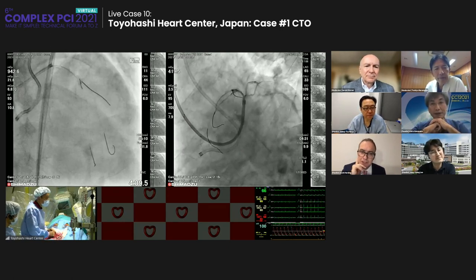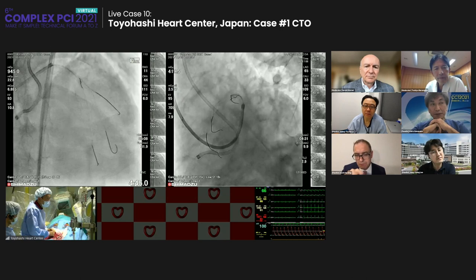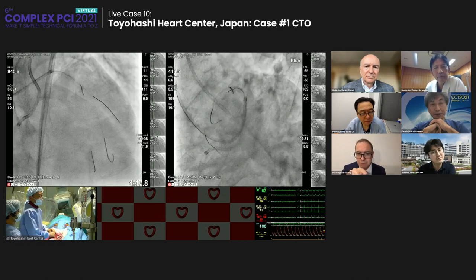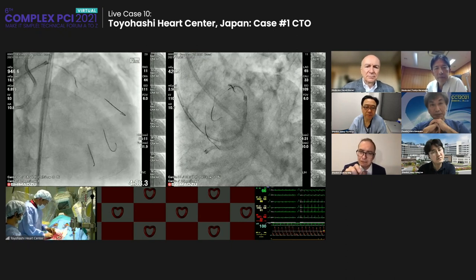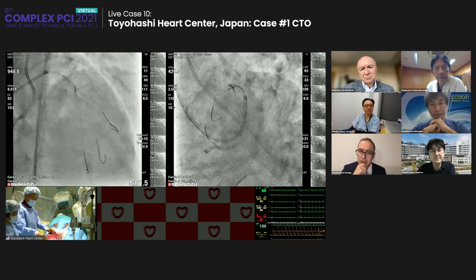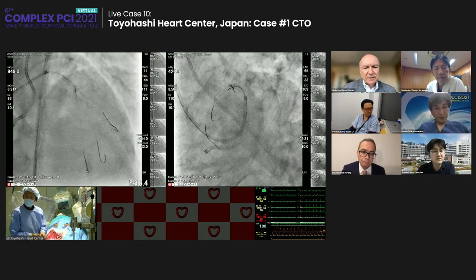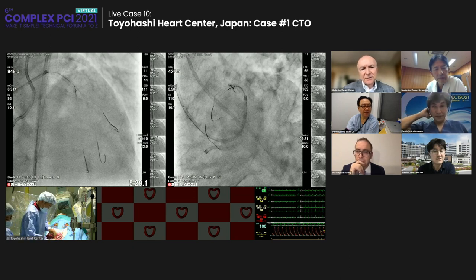If you're going to do that, you could put a short stent from distal in the diagonal across the bifurcation to the proximal diagonal, and then take a larger size stent, like a 3.0, from the proximal diagonal back into the LAD, so you don't have the problem with size mismatch if you're going to do that culotte stent. If you took a 2.5 stent, you could extend it to the proper size. Sometimes you can taper some stents, right?